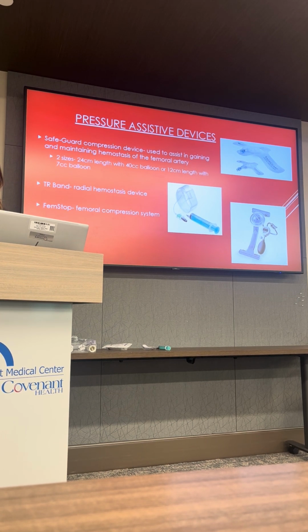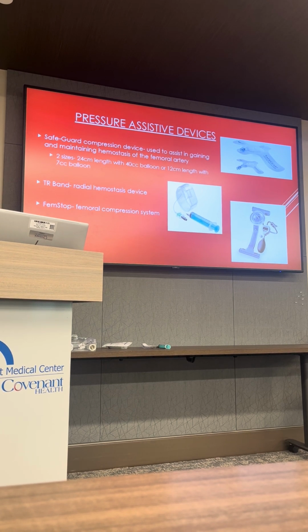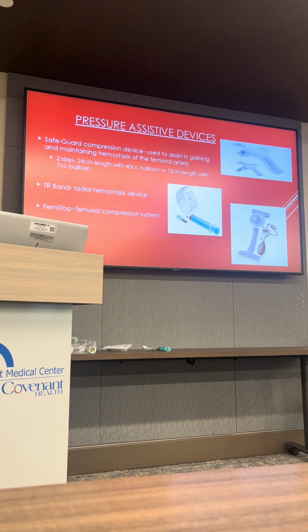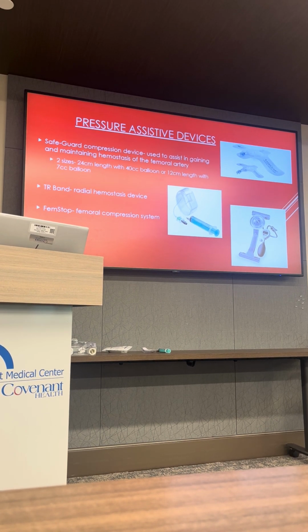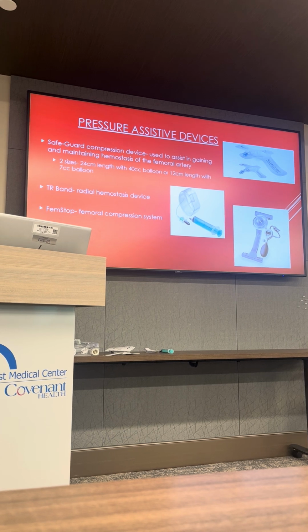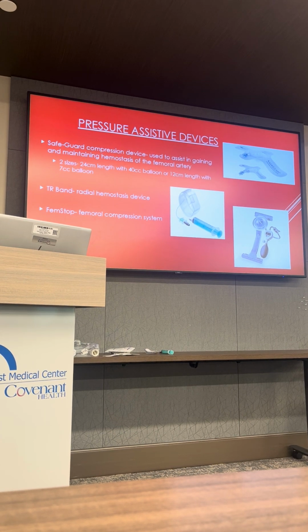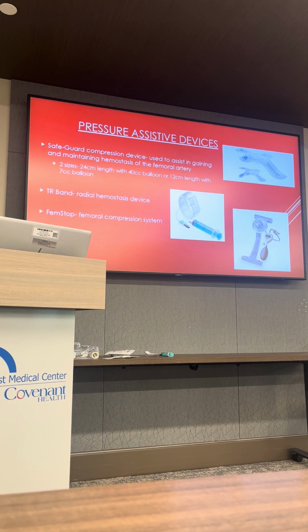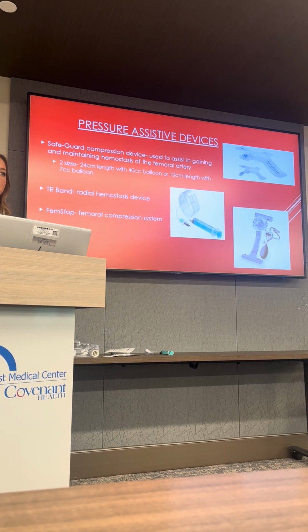These devices are not to be used in place of manual pressure. These are just to assist post-procedurally. So this is not something that you're slapping on because you're concerned that there's still some oozing and different things like that. Again, manual pressure is going to be the gold standard in those cases, but these devices are used for short periods of time to assist with obtaining and then maintaining that hemostasis, like I've said. Typically these stay on just for a few short hours, and we're gradually removing some of the air from these devices as they're in place.